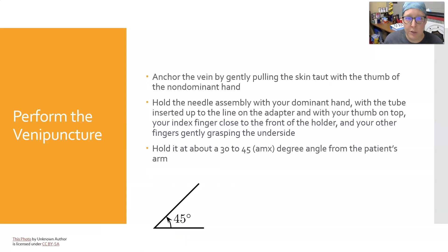Next, perform the venipuncture. Anchor the vein by gently pulling the skin taut with the thumb of the non-dominant hand so you're holding it in place and making sure it's not going to roll. The median cubital usually doesn't roll, but it's not a bad idea to hold it. Hold the needle assembly with your dominant hand with a tube inserted up to the line on the adapter without pushing it onto the second needle, thumb on top of the adapter, index fingers close to the front of the holder, and other fingers gently grasping the underside.